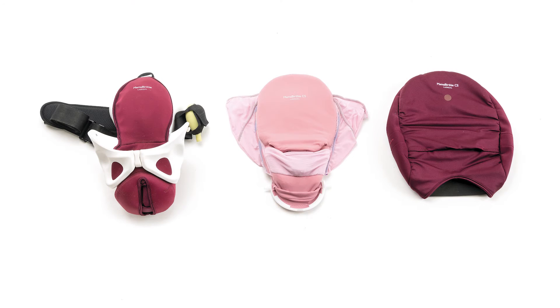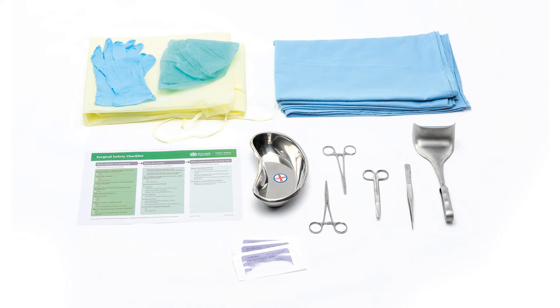For this simulation, you'll need Mama Berthy with the CS module including uterus and abdomen skin. In addition, you'll need surgical instruments and personal protective equipment that are not included. You'll need scrubs, drapes, suture, and instruments for suturing.